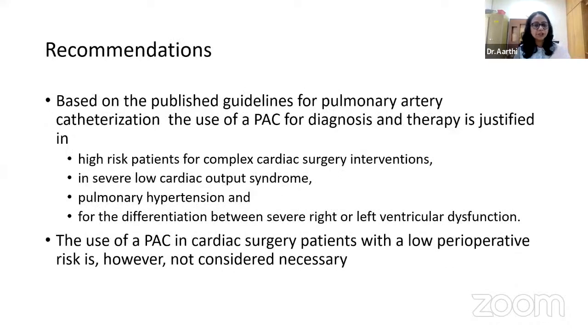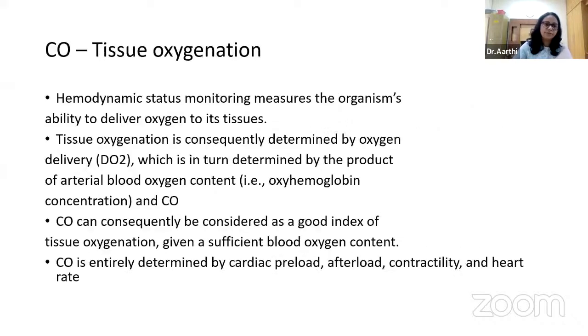So what are the recommendations? As I said earlier, the indications of PACs based on the guidelines: patients with high risk for complex cardiac interventions, in severe low cardiac output syndromes, and patients with high pulmonary hypertension, where you have to have the diagnosis and differentiation between the severe right and left ventricular dysfunctions. And there is no role for PACs in low perioperative risk patients at present. So these are all the overviews about the invasive monitors.